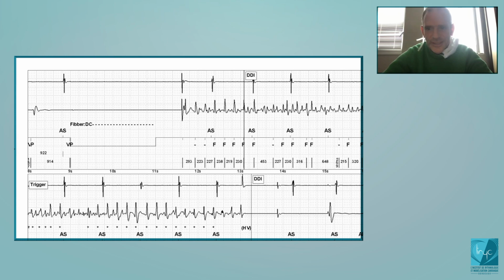You understand? Yes. And that's the reason why when there is a patient, for example, with not so good quality of sensing, I will always consider an Abbott ICD, because the way they are classifying the cycles has been designed to at least decrease the risk of not treating ventricular fibrillation in case of undersensing.